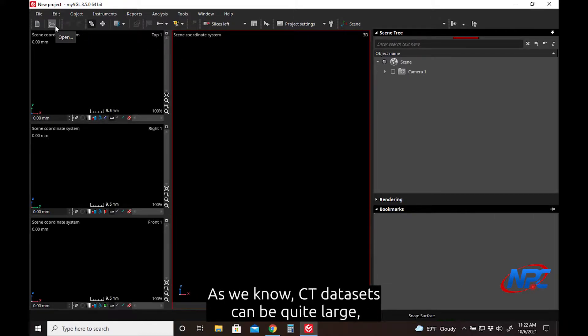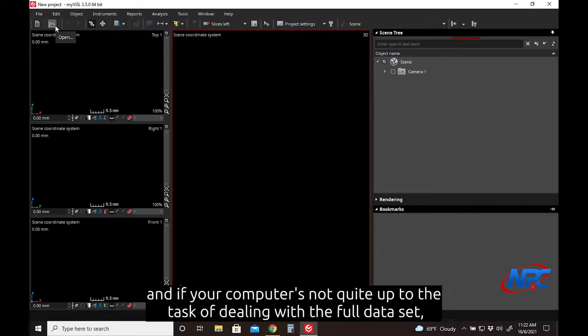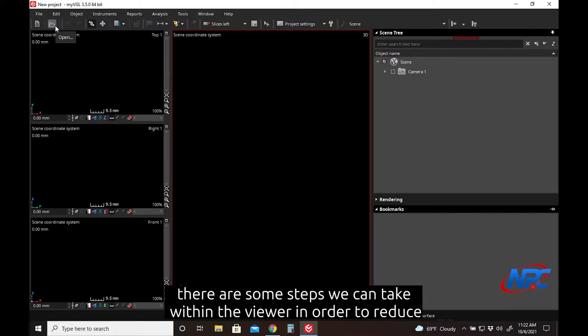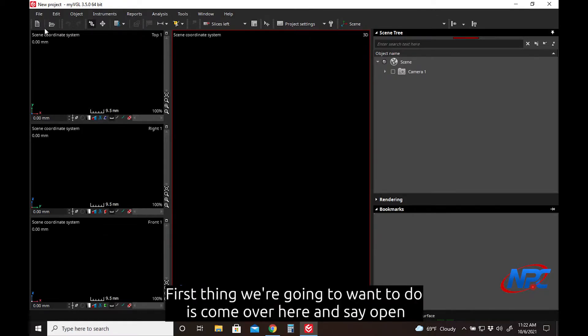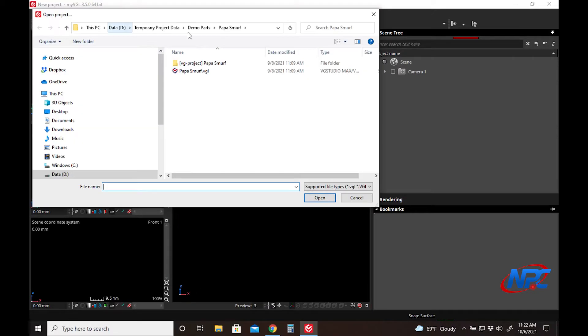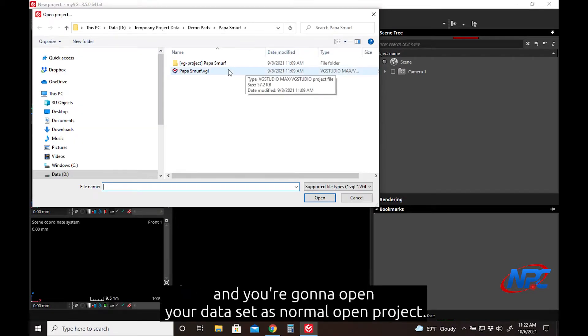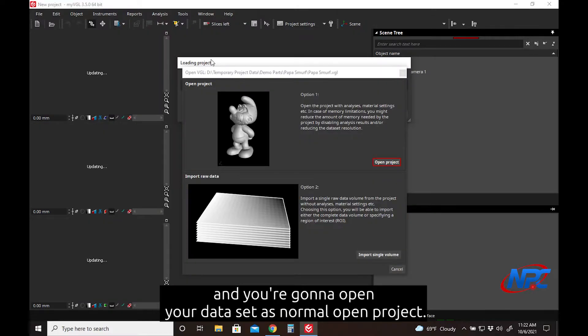As we know, CT data sets can be quite large, and if your computer's not quite up to the task of dealing with the full data set, there are some steps we can take within the viewer to reduce the demands on your computer so things run a little more smoothly for you. First thing we're going to want to do is come over here and say Open, and you're going to open your data set as normal.